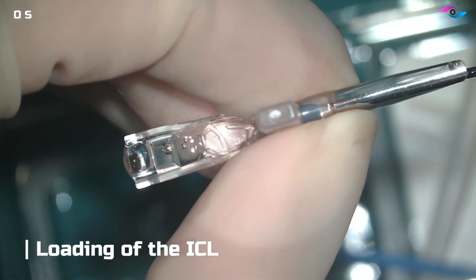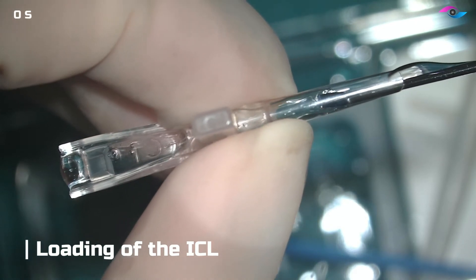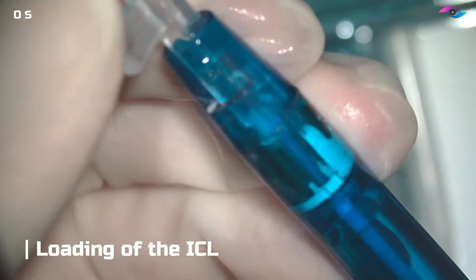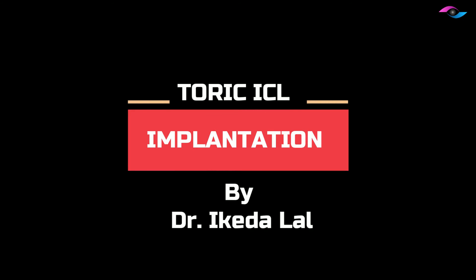We are using the special ICL pull-through forceps, and the trick here is to move the other hand back instead of pulling the lens with the forceps. Once this is loaded, we place it inside the injector and rotate it until we hear a click, then advance the sponge tip applicator. The next step is implantation inside the patient's eye.